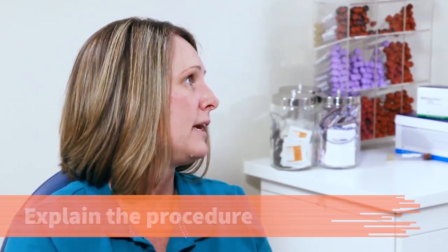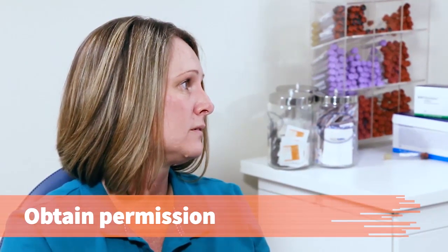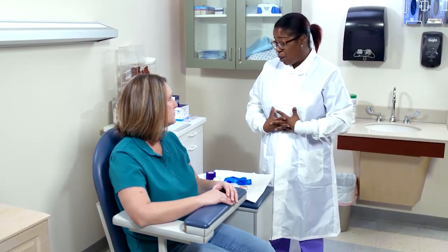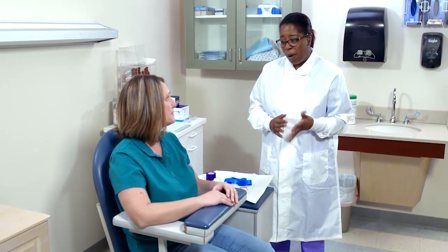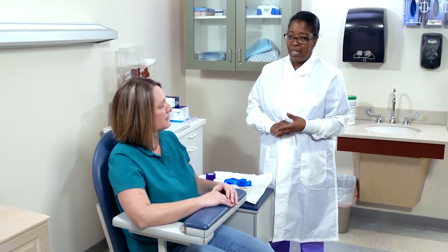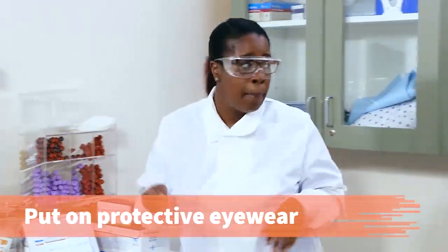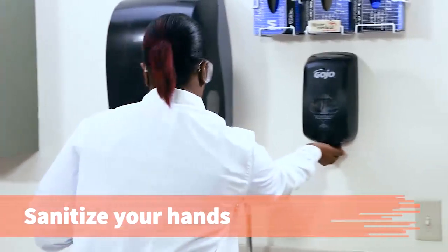Explain the procedure and obtain permission for the venipuncture. Tina, it looks like Dr. Anderson has ordered some blood work for you to have done today. Do you have a problem with getting your blood drawn or had any issues? No. Okay. Put on protective eyewear and sanitize your hands.